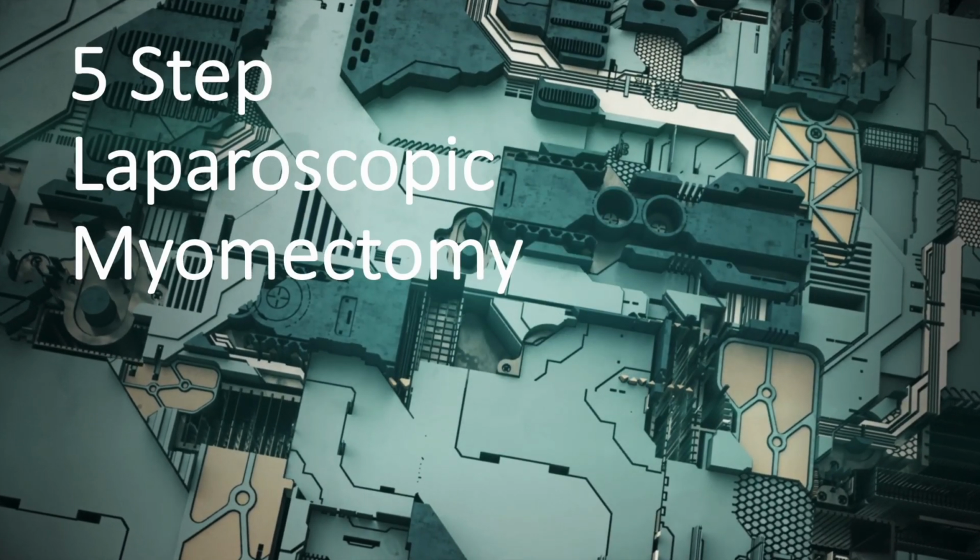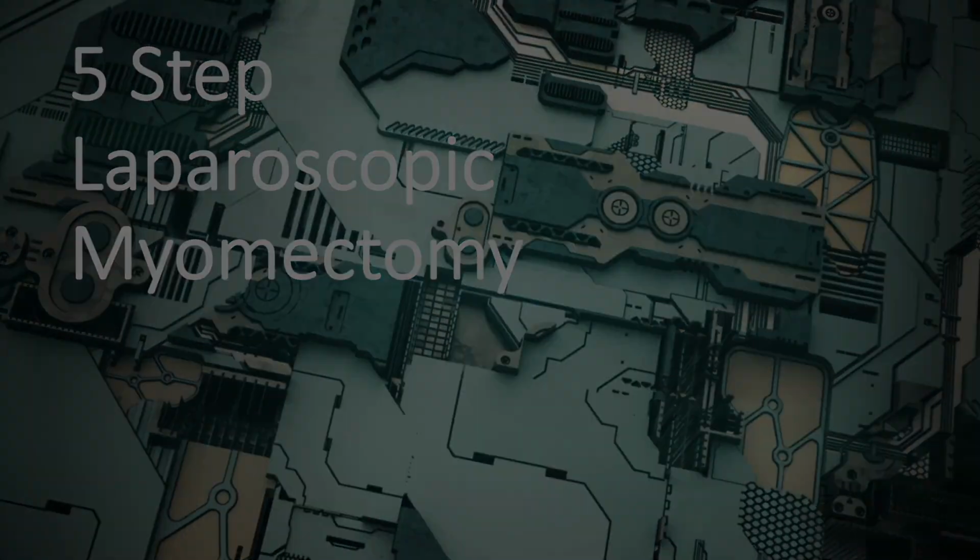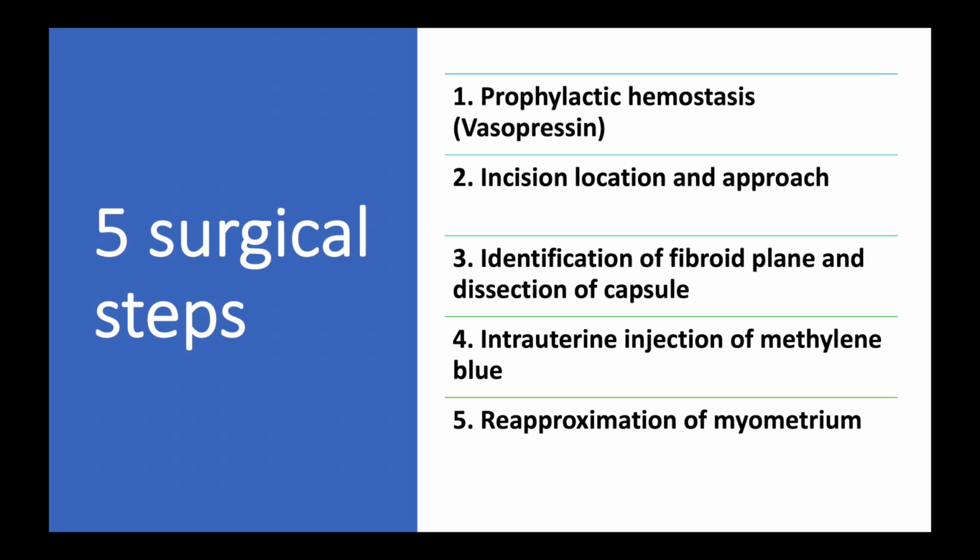The 5 steps of the laparoscopic myomectomy. Step 1 is prophylactic hemostasis with vasopressin or temporary ligation of the uterine blood supply. Step 2 is deciding on the best incision location. Step 3 is to identify the fibroid plane and dissect the fibroid from the uterus. Step 4 is to inject methylene blue into the endometrium. And step 5 is reapproximation of the uterine layers.